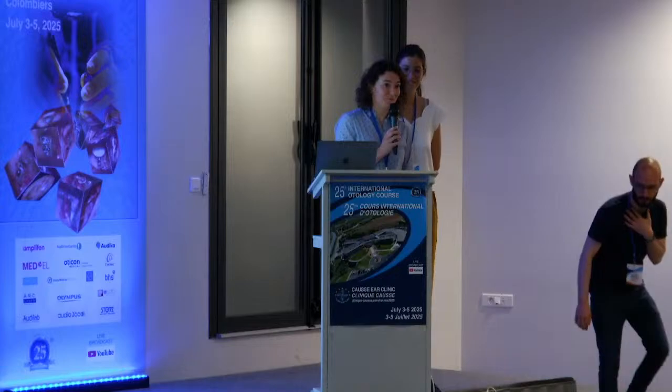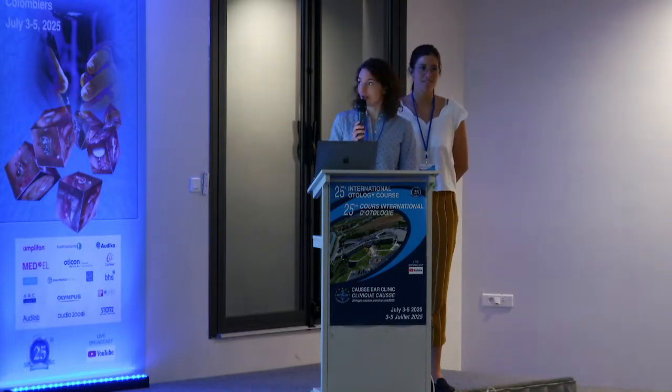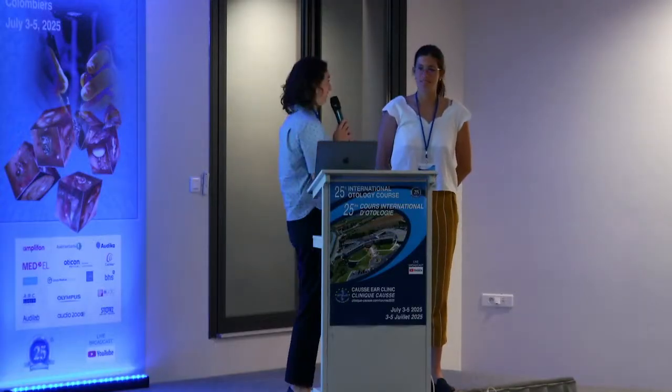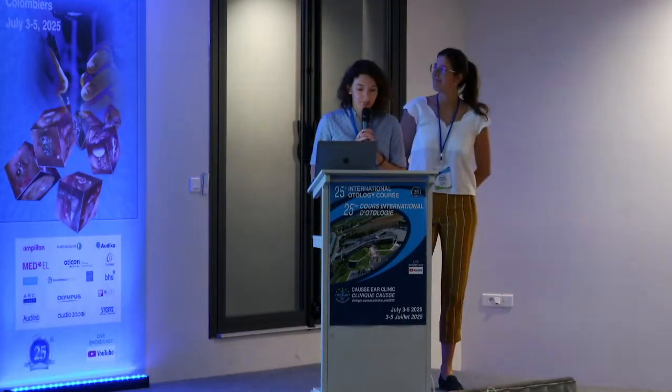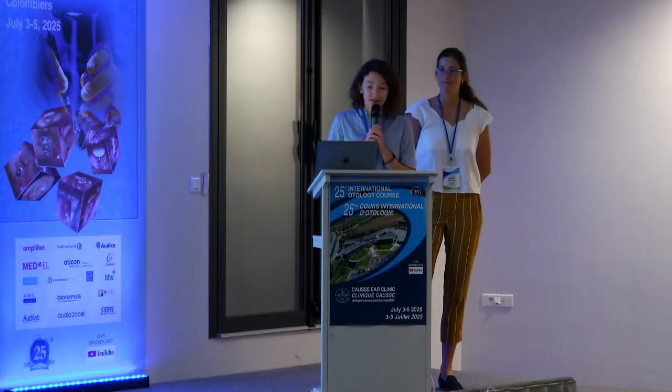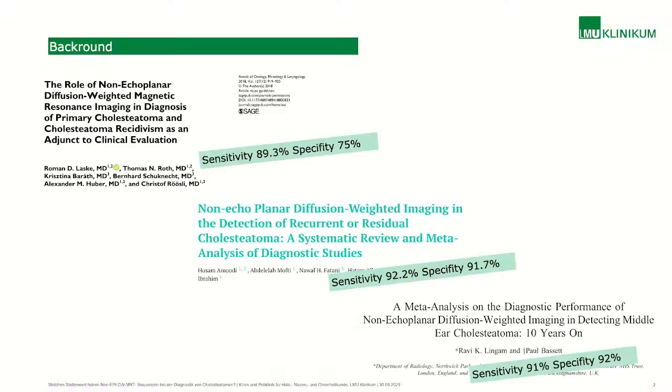So thank you. We appreciate the opportunity to give you a quick overview of what we are currently doing. First, I would like to thank my colleague Andrea Schreier. We started this project together. In the last years, MRI became more and more common in follow-up after cholesteatoma surgery, and has shown detection rates up to 90%.